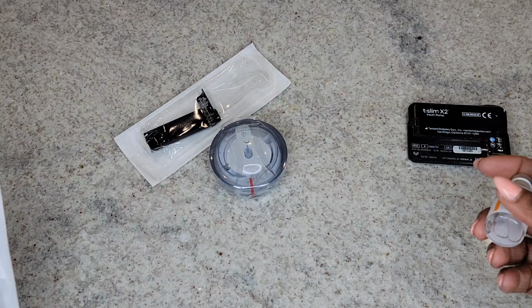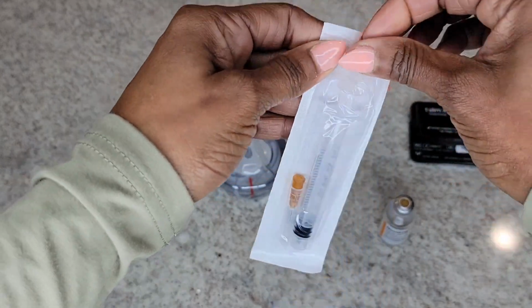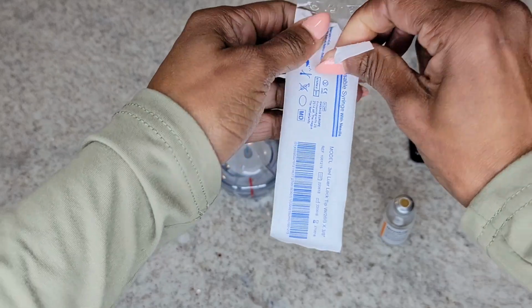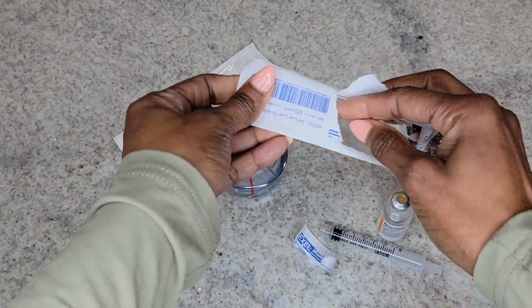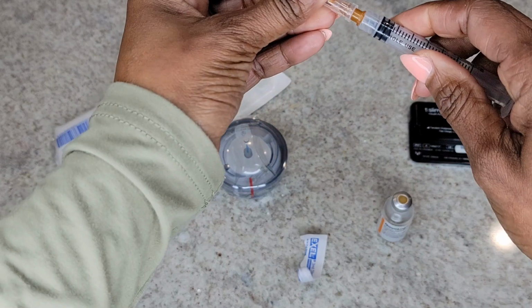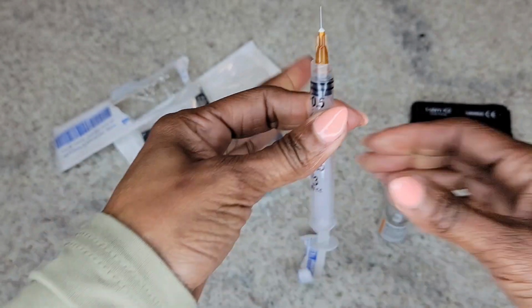I know that's right. So now I have my insulin, which I am on Novolog. And then this is the syringe which I'm going to use to get the insulin from the bottle to the new reservoir set. Now, this is large and intimidating, but this needle does not actually stay. And I'm gonna show you guys in a minute. So, I'm gonna attach this, take that top off. Yeah. It's a big one.